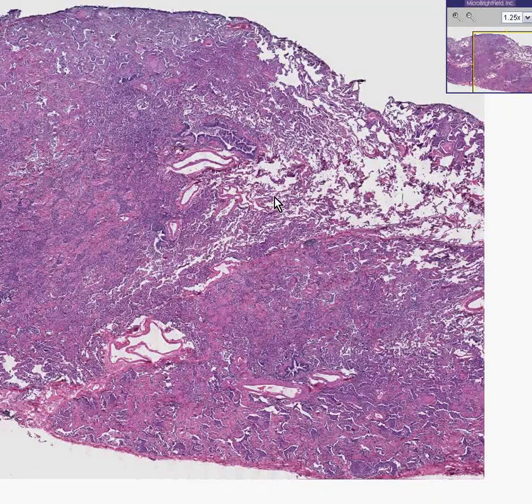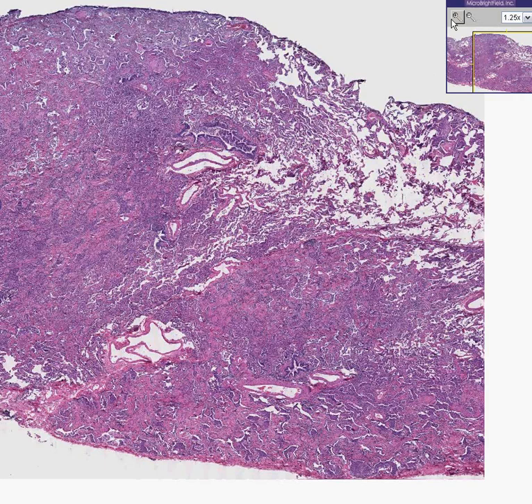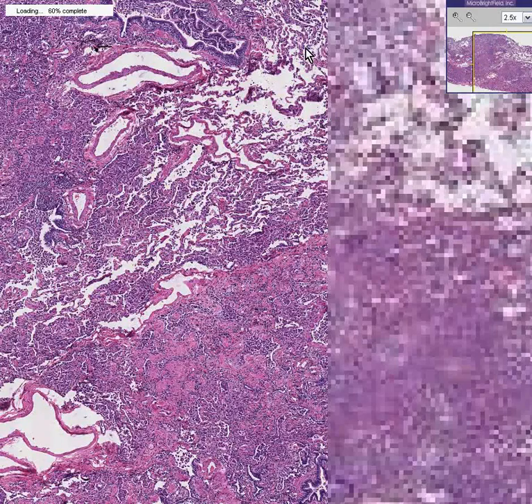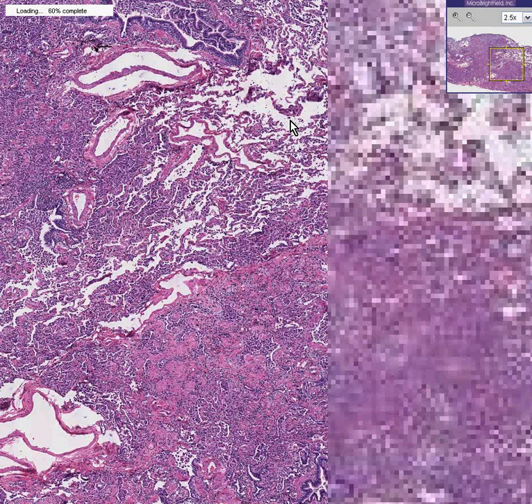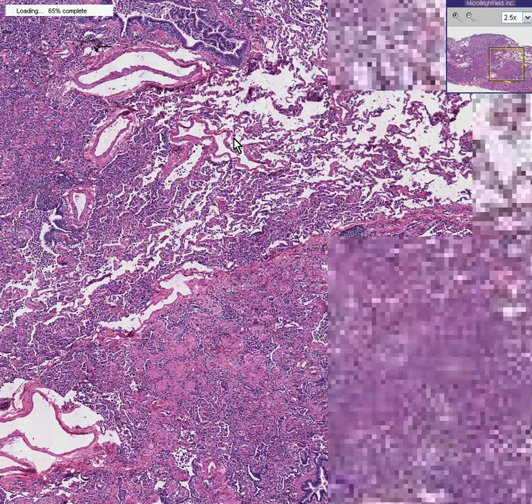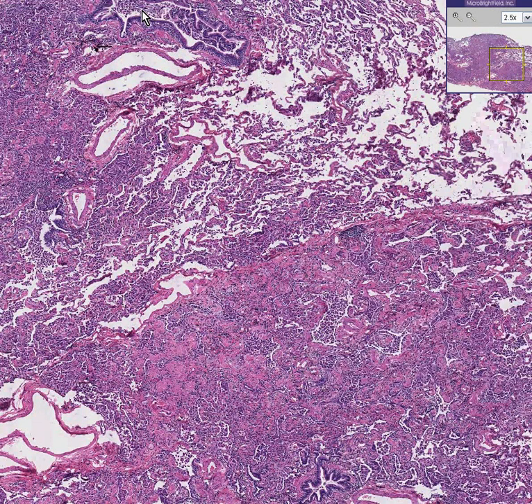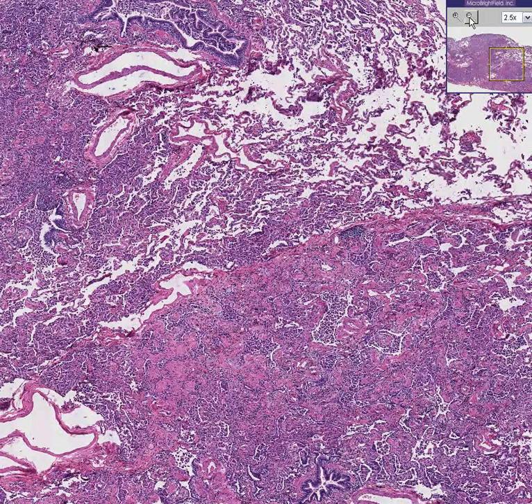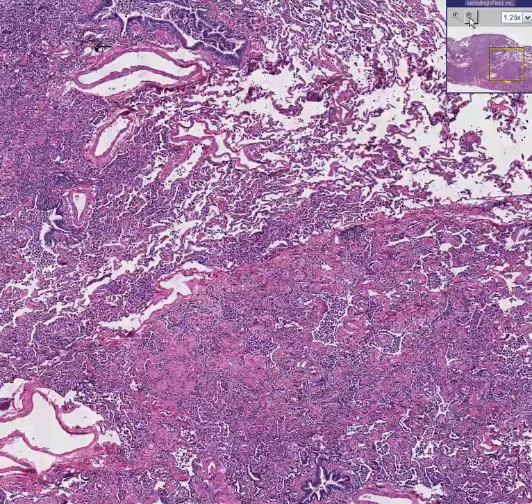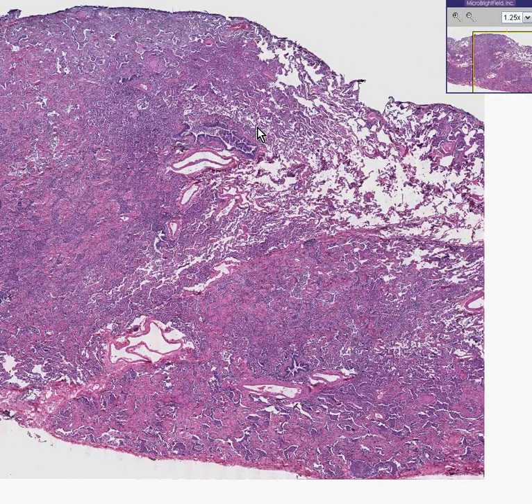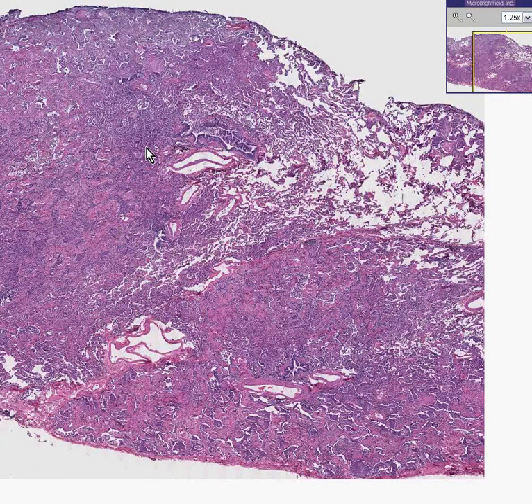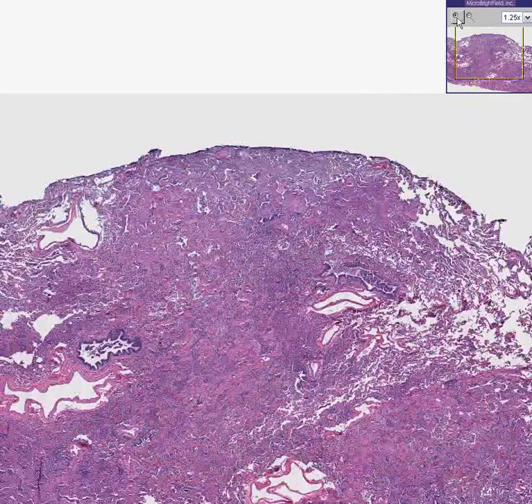I could probably convince you quickly this is lung because you can see areas out here that look like air spaces. If you look more carefully you can see that we do have alveoli with septae, but that's only in a relatively small part of this tissue. We can see bronchial mucosa here, we can see a large vessel here. Strikingly, however, most of the lung does not have air spaces — it's consolidated and the alveoli are filled with junk.